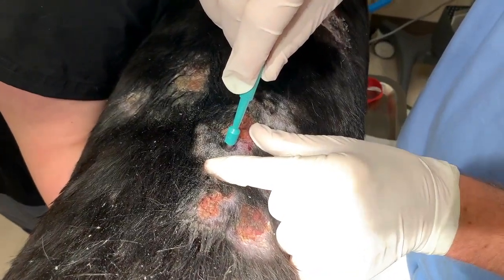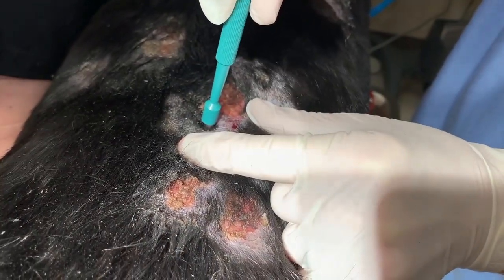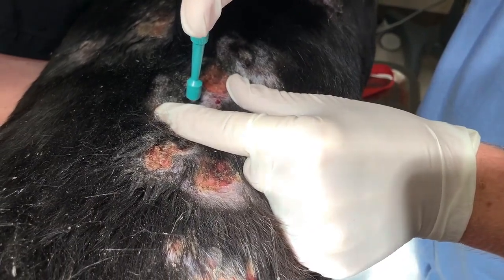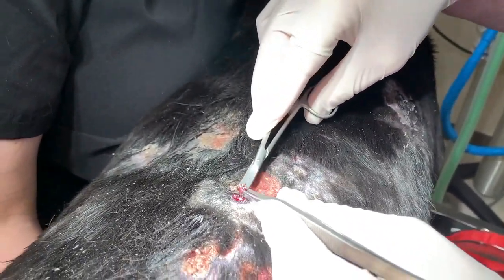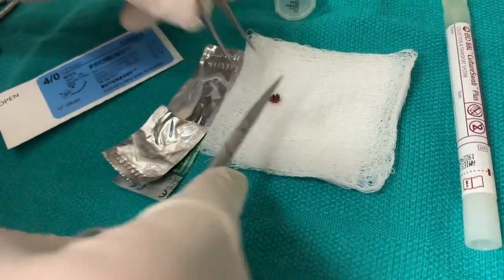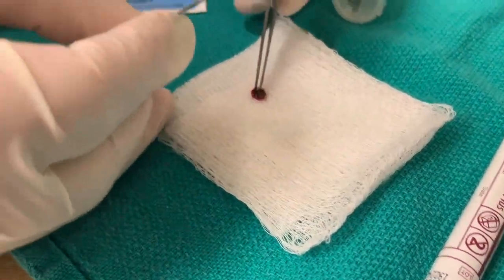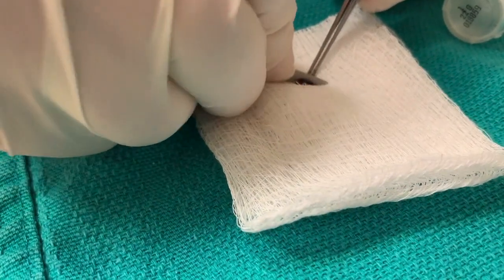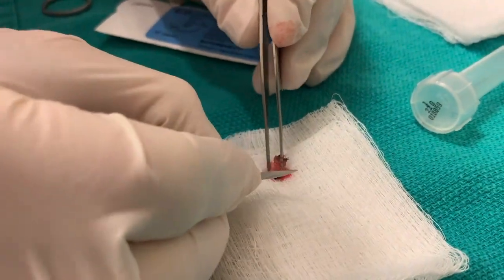The idea is to contact the skin over the entire circumference. Just kind of light pressure, spinning it in one direction ideally. Sometimes I'll spread the skin a little bit to make it more taut. Now I'm just going to try and lift this out — take the biopsy specimen. This is where I was going to try and take a tissue sample, so I'm going to bisect it first this way, and then cut off the epidermis, hopefully.